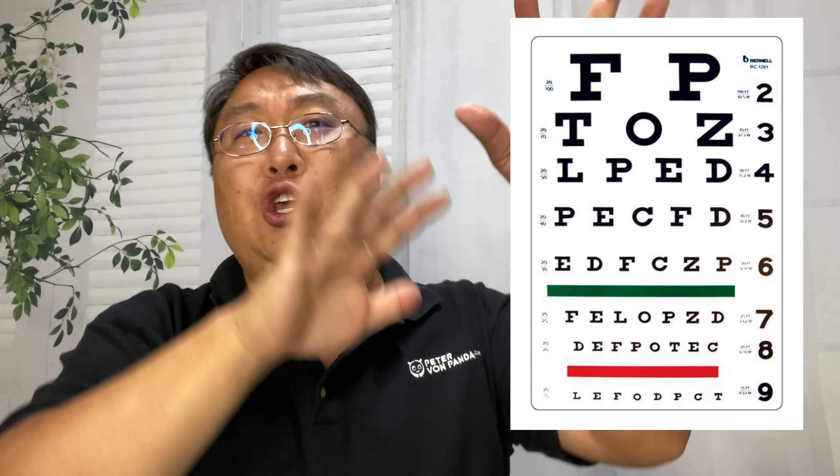First, you're going to need to give yourself that vision test — this is the test where you normally look at a chart on the wall and say E, P, Q, F. I didn't think you could mimic that at home, but this little device will do almost everything that does, and it's super easy to use.